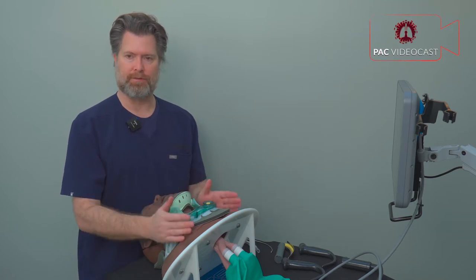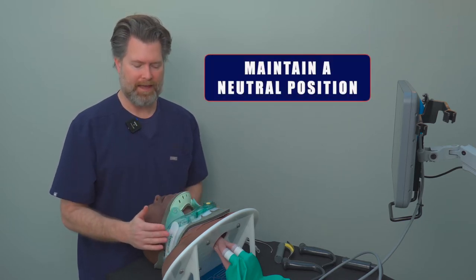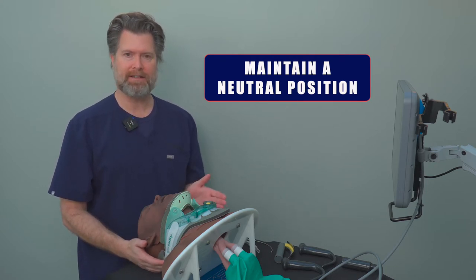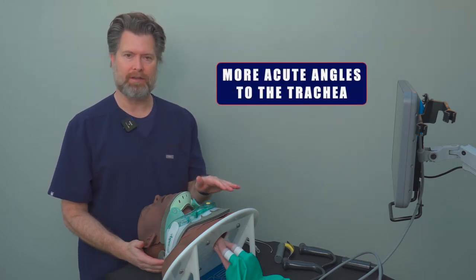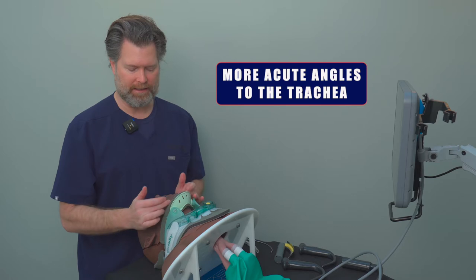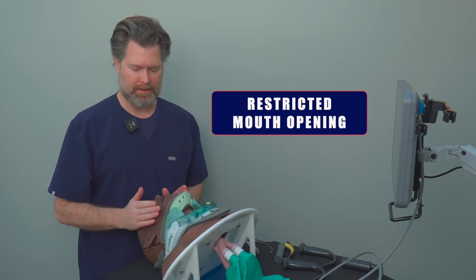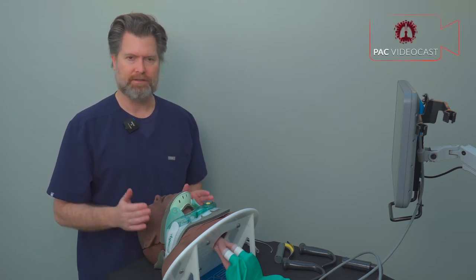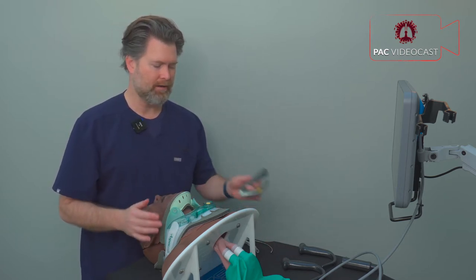A few reminders about managing patients with cervical spine injury during intubation. First, they need to remain in the neutral position — you are not able to elevate the head, put them in the sniffing position, or the ear-to-sternal-notch position, which makes the passage to the tracheal opening more difficult with more acute angles and worse views. Second, the collar fits snugly against the chin and jawline, restricting mouth opening and leaving less room to work and maneuver.